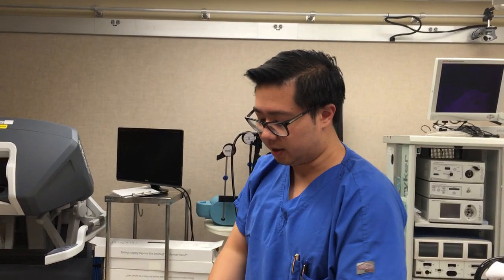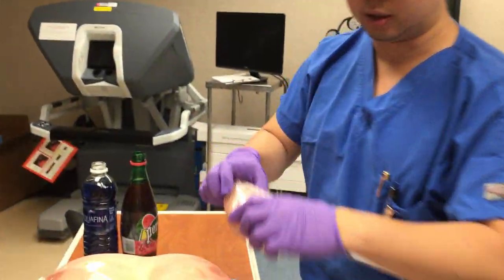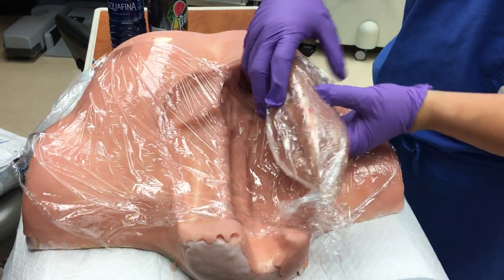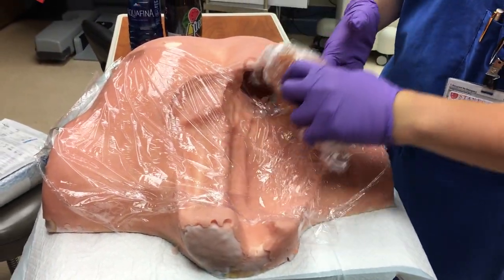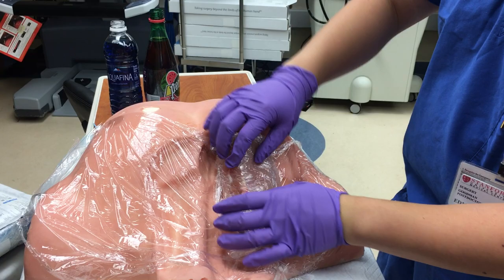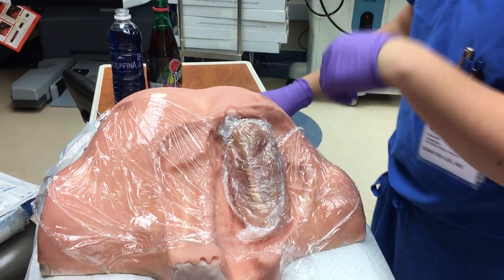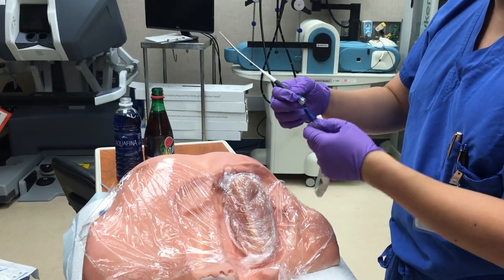Ideally, we would like the chicken to lay flat right here like this — maybe the beefier side towards the neck. So, now that we've established our landmarks: this is going to be lateral, this is going to be medial. We know that the vein is lateral and the artery is medial.